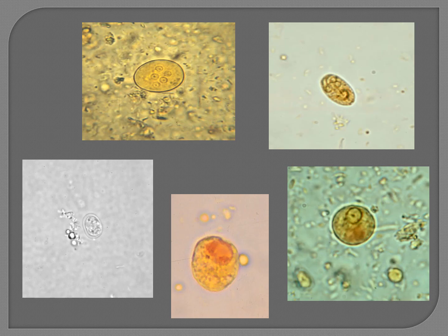And then on the bottom right, this is Entamoeba histolytica, where you can see we have one nucleus, and inside that nucleus we have fine peripheral chromatin and a karyosome that's placed right in the center of the nucleus. Okay, and then there are no chromatoid bodies in that image, but there could be in Entamoeba histolytica.